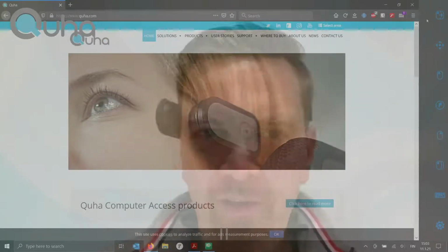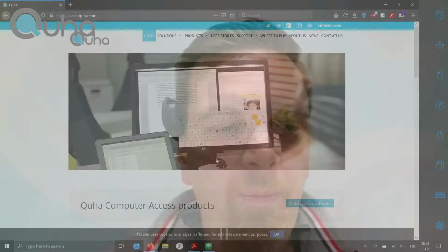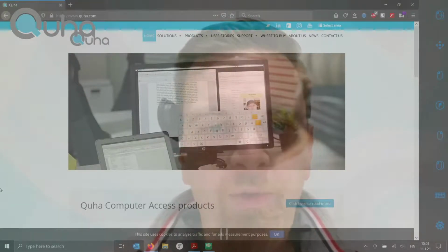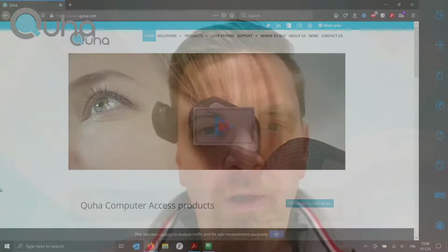Okay, and I exit the gesture. Now I want to switch back to the eyegaze, so I start by pausing the Quha Zono 2, and that's also done by a gesture. Now it's paused, and now I unpause the eyegaze, like this. So now the eyegaze is active again.